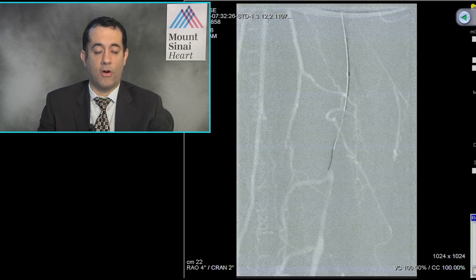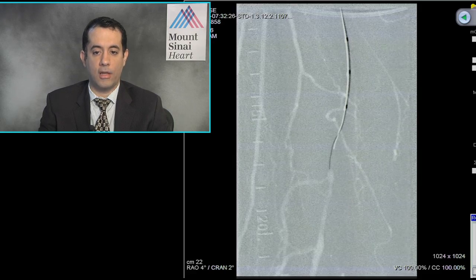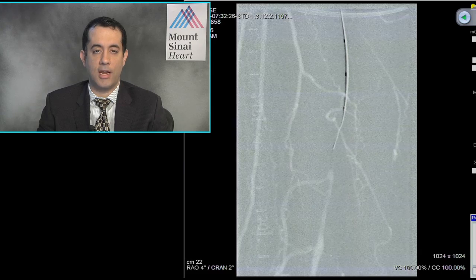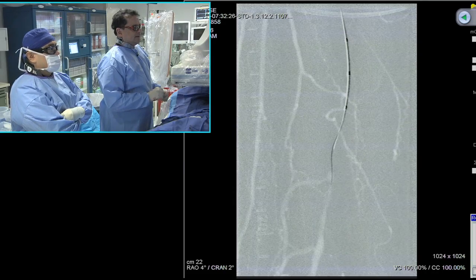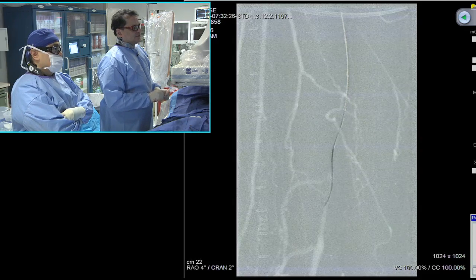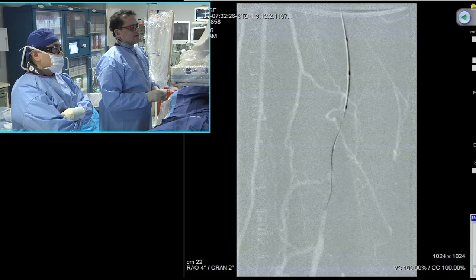So, in your case, it worked perfectly fine because the initial part looks more chronic thrombogenic, and distally there is a cap as well. So it's probably just adding to the complexity. Yeah, right here, this cap is clearly being a pain in the neck, but it seems like our 014 wire did the trick there, as you can see by the movement of the wire. So this is a great case to really talk about this.